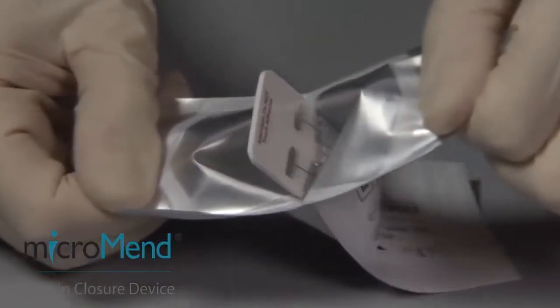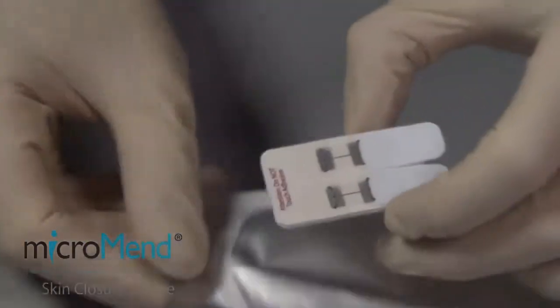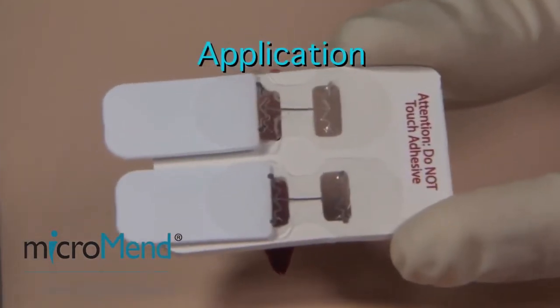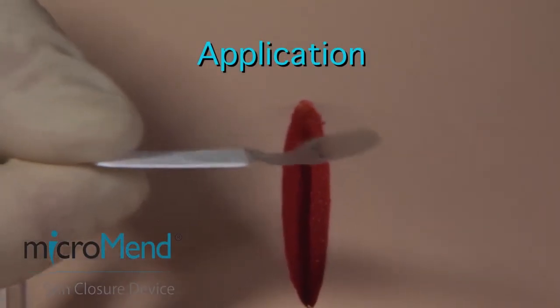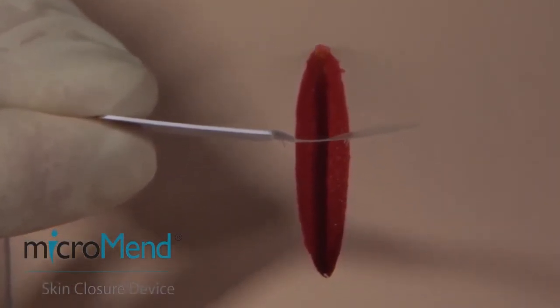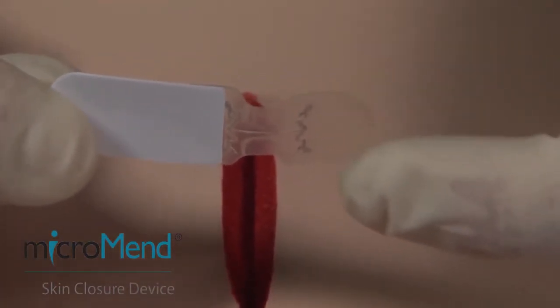Peel open the pouch and remove the devices. Peel off the device using the white applicator tab. During the entire application procedure, it is critical that fingers do not touch the clear adhesive backing, or it will damage the device.